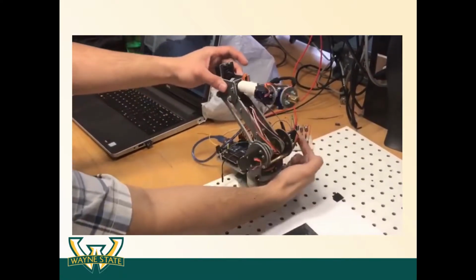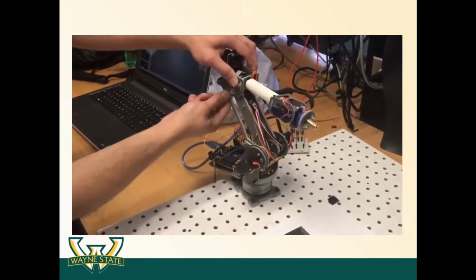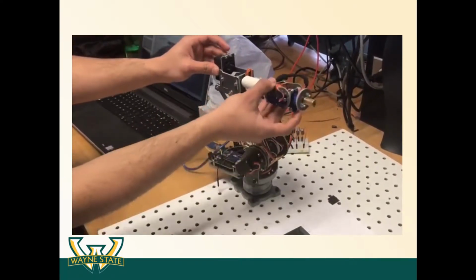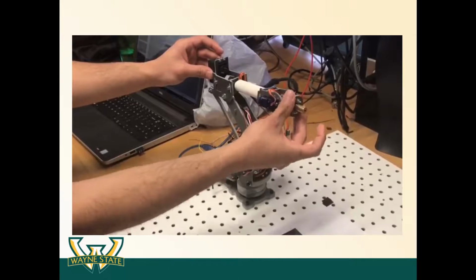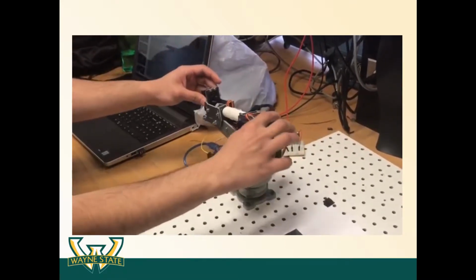The second joint is this one. The third joint is controlled by this servo, and the third joint is over here. You can see this is our third joint. This is our fourth joint, which is a revolute across this, and this is the fifth joint, and this is the sixth joint, which we are not using, but these are just controlled by the fifth joint.